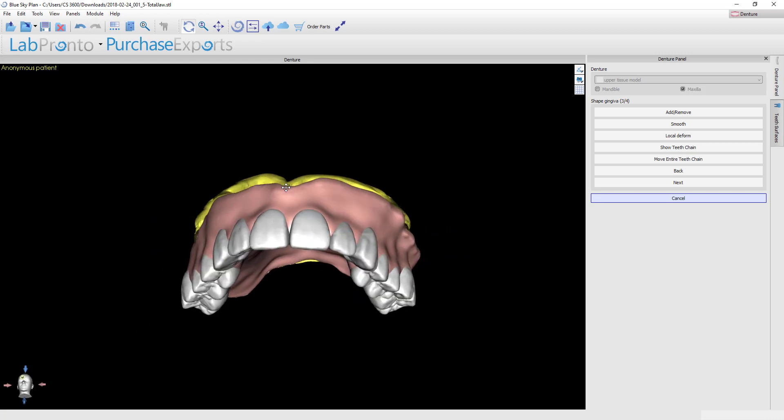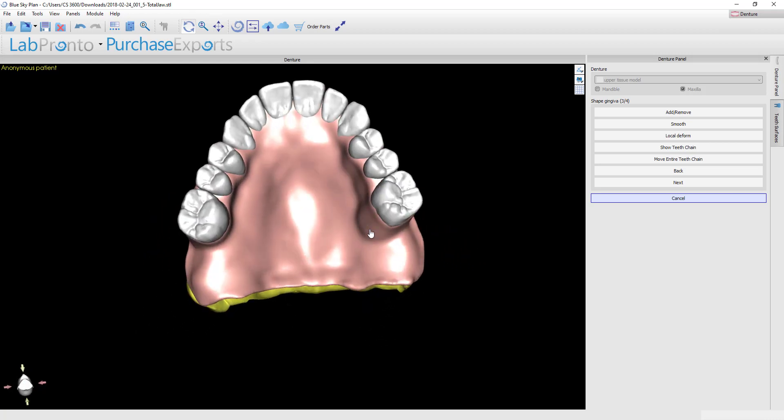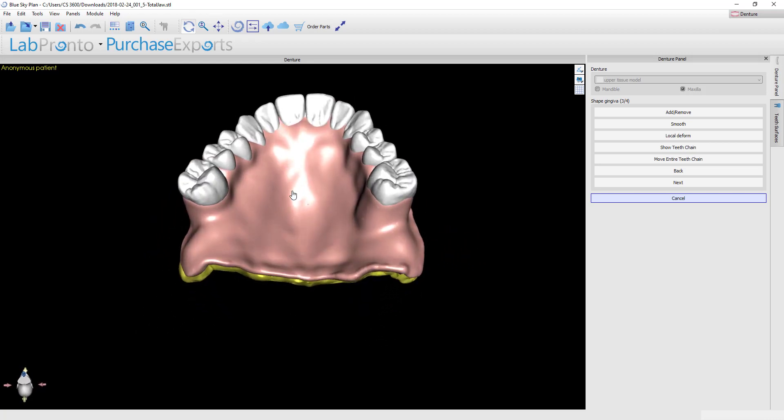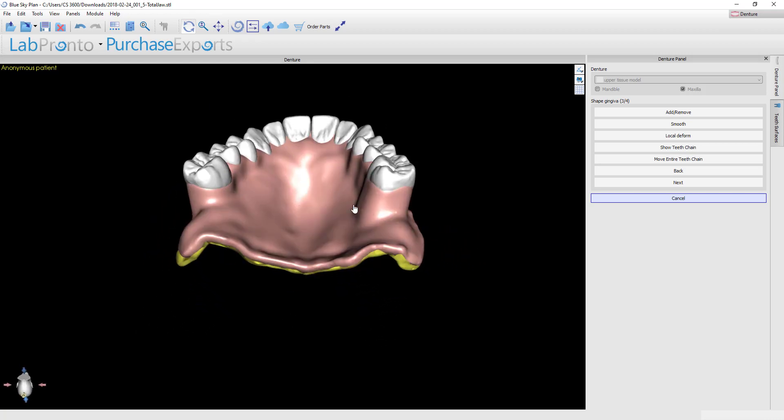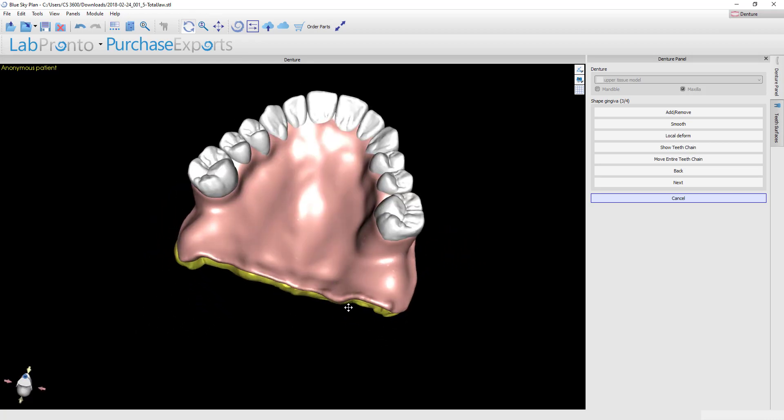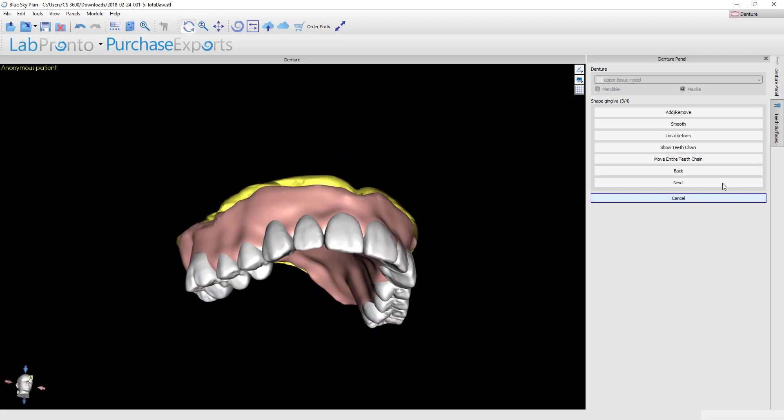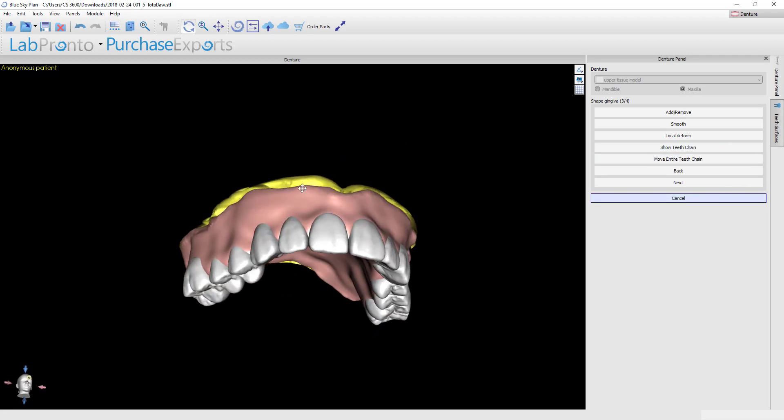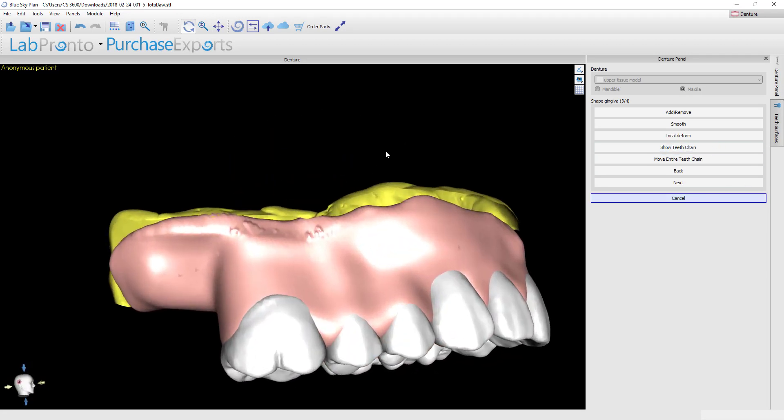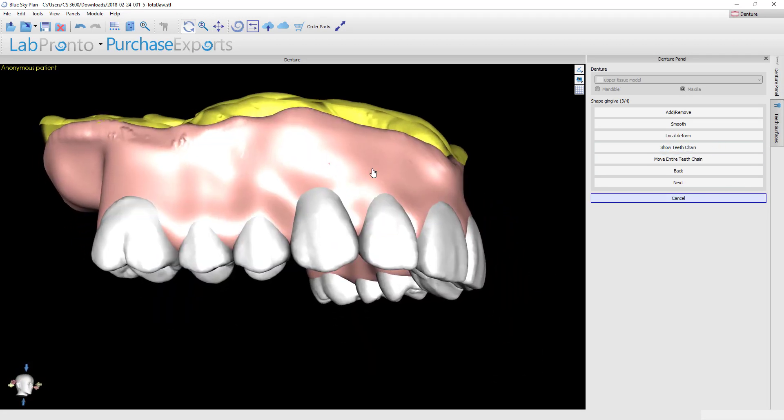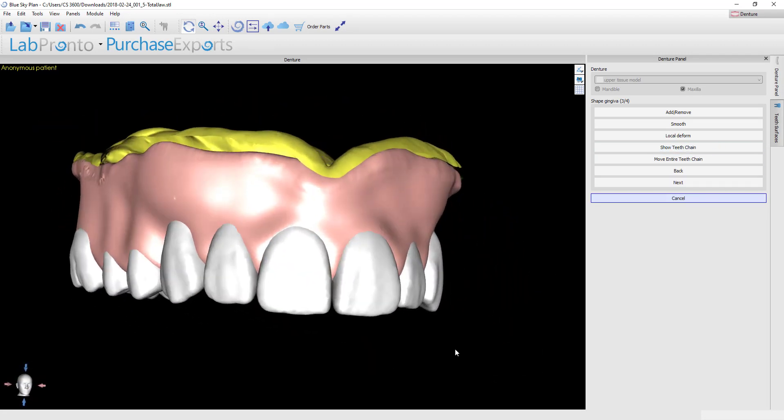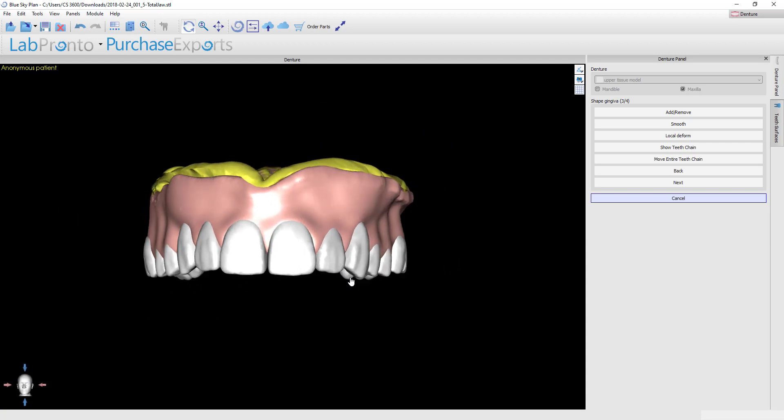With this new gingival proposal, you can see that it overall has a lot more smoothness to it because of the smoothing application that we applied in the last step. Now once you're happy with the overall shape of the base, you're ready to begin doing your gingival festooning. I'll go through the tools that you have available here one by one.